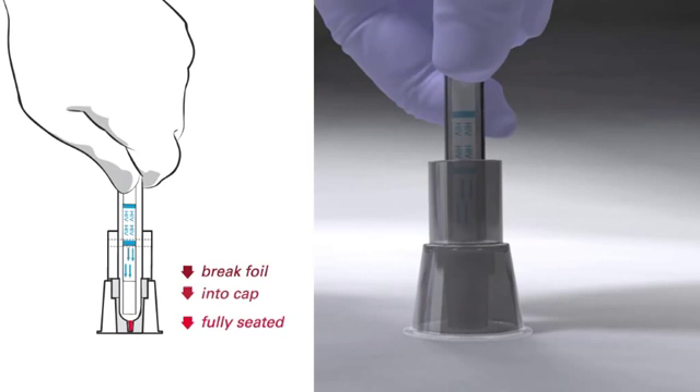Important procedure note: when inserting the test device into the buffer cap, it's important that you push — not jab — the tip very hard through the foil cover and into the buffer cap until it completely snaps into place.